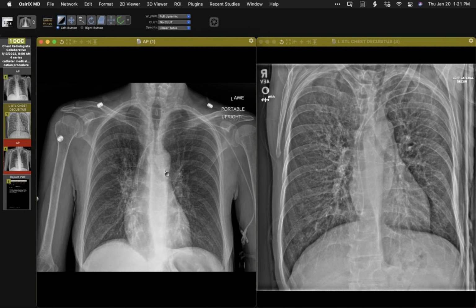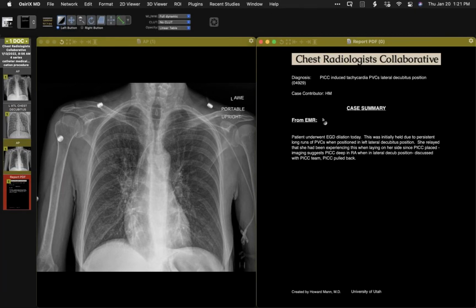Yeah, really interesting. That's nice. That's one I've encountered. Yeah, because I was perplexed when I was presented with that to read. I thought, what's going on? And then I looked in the medical record, and the physician, pretty attentive, called a little bit after and said, hey, this is the scoop. So there you have it. And I think they took it out subsequently because I think it was put in for some temporary reason, in the context of some GI issue. So there you have that one. It's nice.